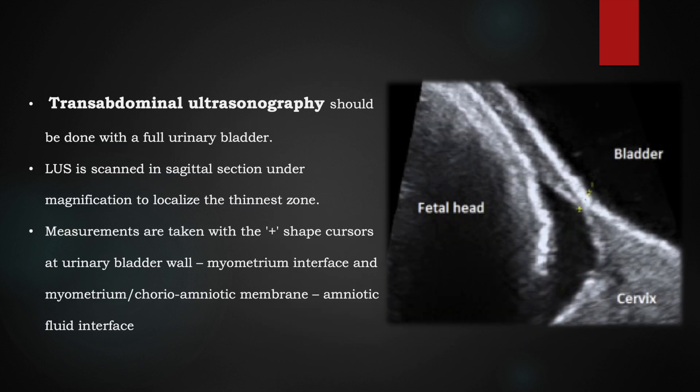For transabdominal ultrasound, we have to do it with an overdistended or distended bladder and take a proper midline sagittal section along the linea alba, magnifying it so we can see the lower uterine segment. We have to localize the thinnest area, and the measurement is taken by placing the cursor between the urinary bladder-wall-myometrium interface and the myometrium-amniotic fluid interface.